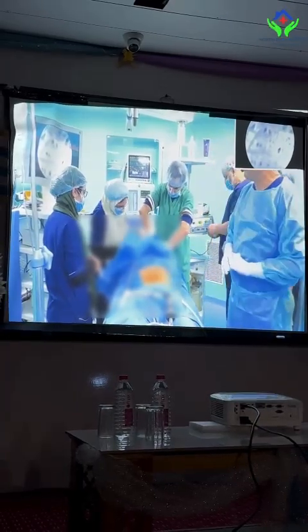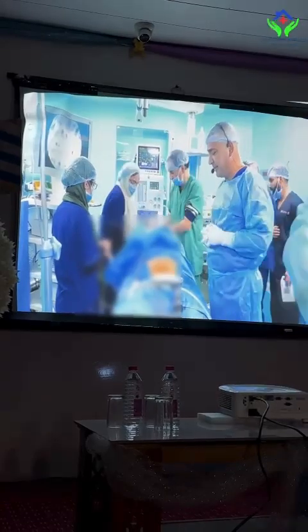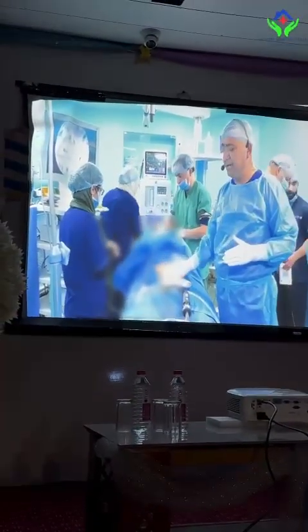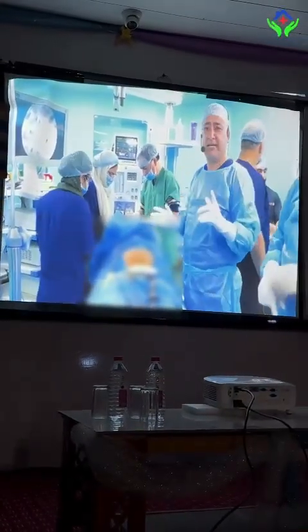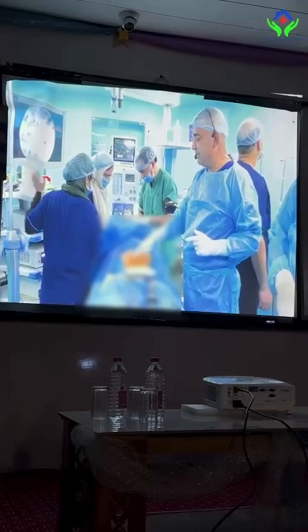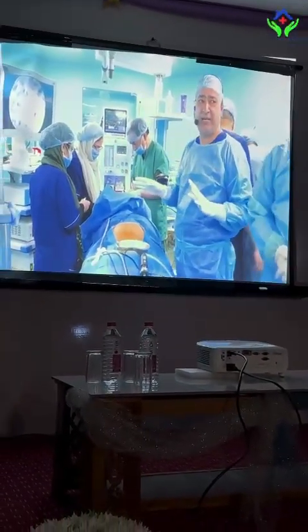So now the principle of port making, which you were talking about. Let me talk about the principle of port making. If my hernia is in M4 and M5, then I would preferably catheterize the patient. In this patient, I have not catheterized. The reason is my area is M3, so I will not catheterize the patient unless there is some other issue for which I need to catheterize.